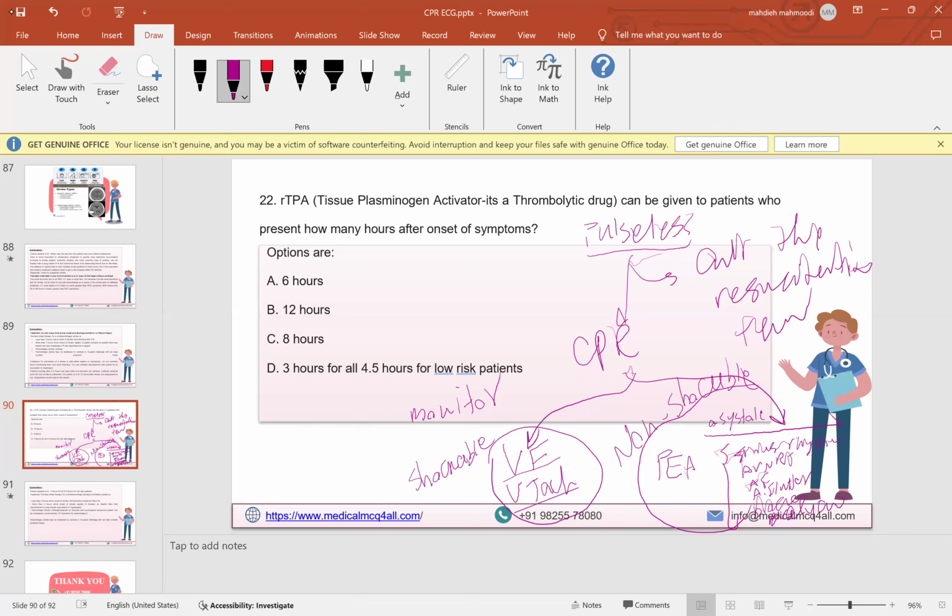Done. And we don't say pulseless VF because all patients with VF are pulseless. So technically, defib only in CPR, and only in the CPR in VF and VTAC. Otherwise, doesn't matter what you see on the monitor, the answer is not defibrillation. Got it?